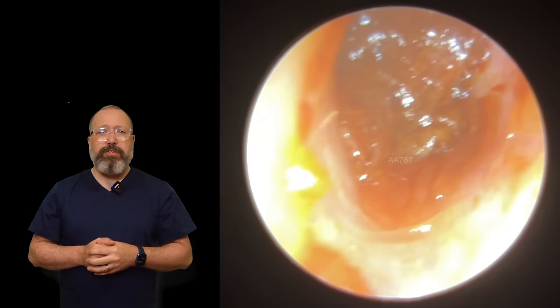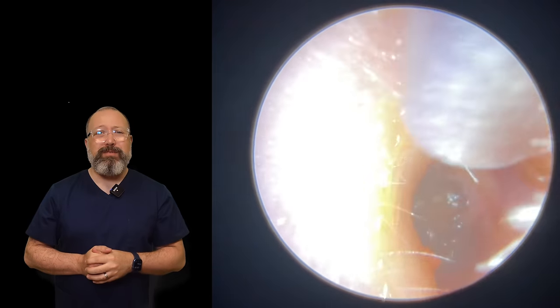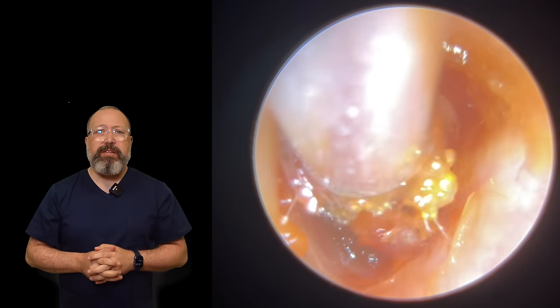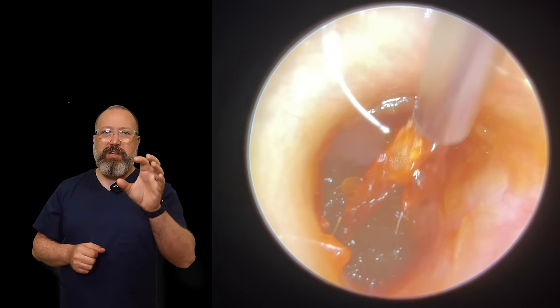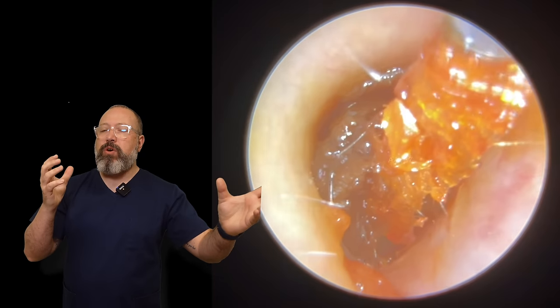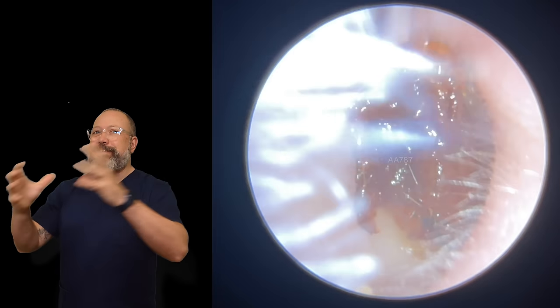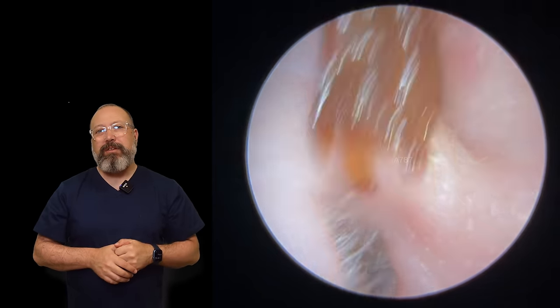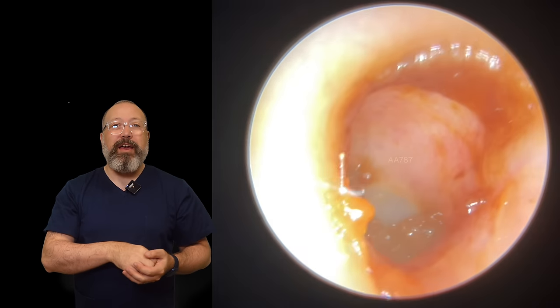This is the second patient in the compilation. You can see a very deep piece of wax almost bang on top of the eardrum, smudged around the outside edge as well. Lifting with the standard size tube — I was hoping it would come away as one big plug. As we pull out we've got this layer of skin. Notice the similarities between the two pieces of wax: those loose bits of skin, the color. You do tend to find wax falls into different categories and you get to know them. This one is a little bit mushy and wet with a piece of dry skin running through the middle.